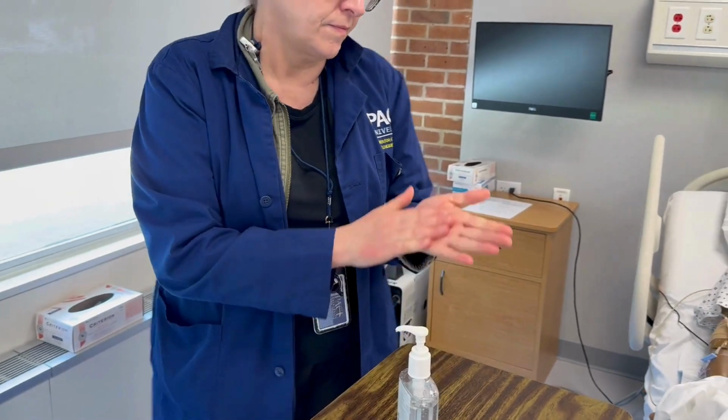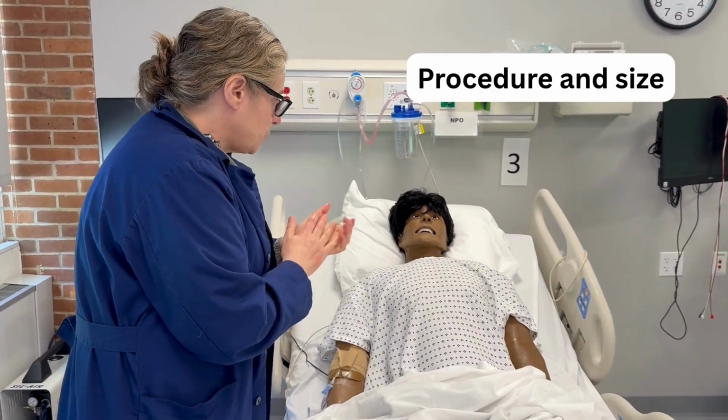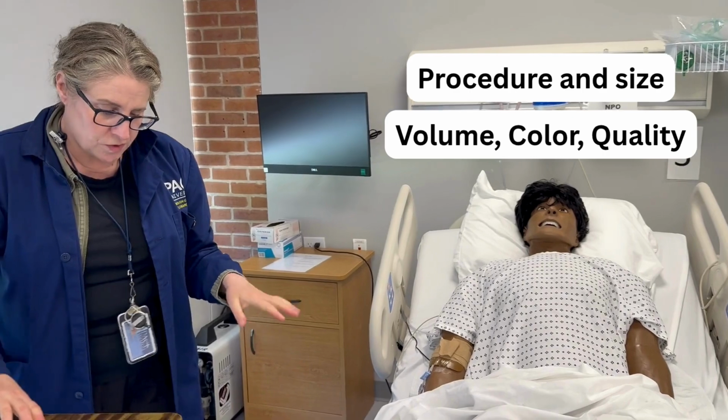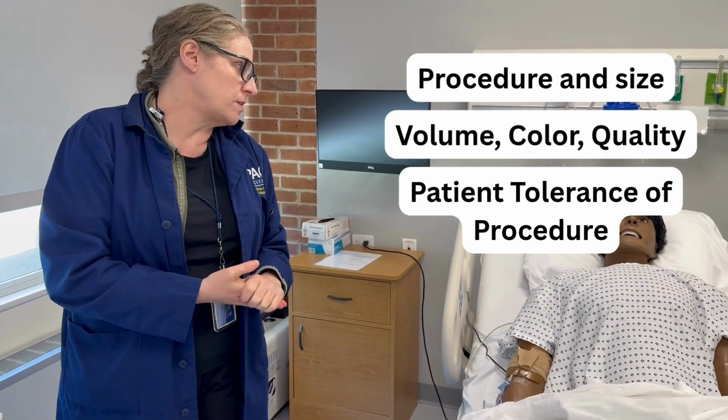Document the procedure. So I'm going to document that I inserted a 14 French Foley catheter, that there was 200 milliliters of clear yellow urine, and that the patient tolerated the procedure well.